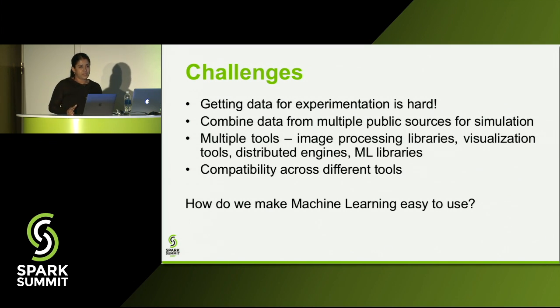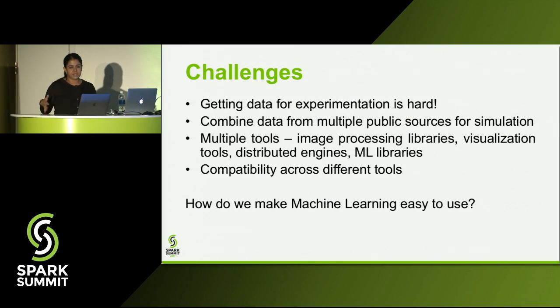Then if you have big data, because each of these images can be massively sized and accompanying them is a ton of metadata, you need to have a distributed system that can do it for you. And then, of course, the machine learning part comes in, where if you want to run your classifiers or regressors, unless you're implementing all of these from scratch, you need to be able to bring all of these components together. And then if you have multiple components, you need to make sure they're compatible with each other. So one format understands the other, so on and so forth. So our main challenge over here, or our main driver over here, was how do we make machine learning easy to use, overcoming these challenges.